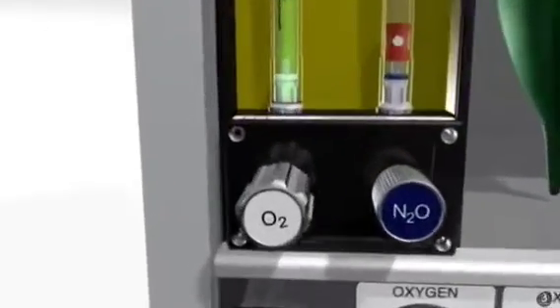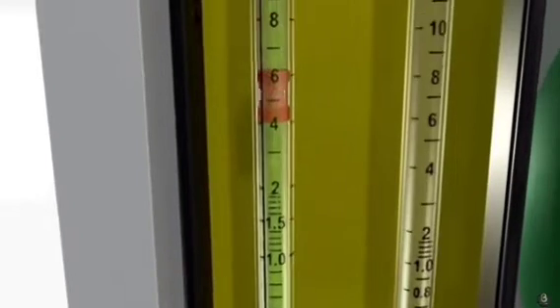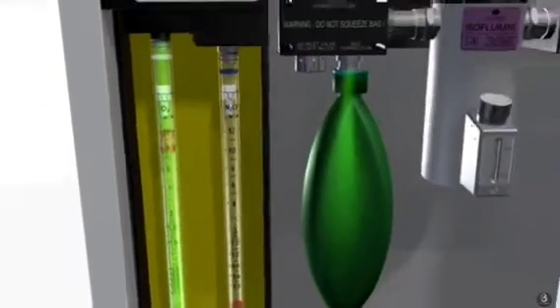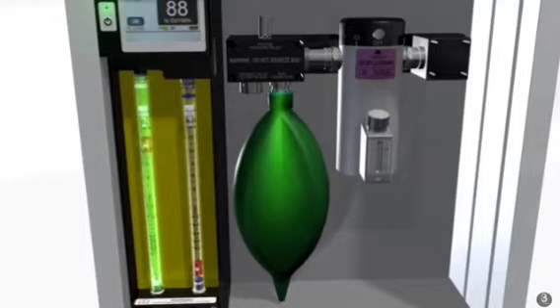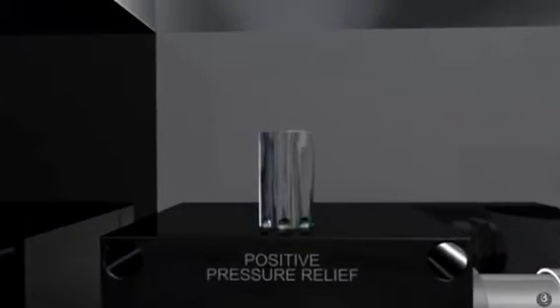Pressure gauges, regulators, and pop-off valves to monitor gas pressure throughout the system and protect the machine components and patient from excessive rises. Flow meters such as rotameters for oxygen, air, and nitrous oxide. Vaporizers to provide accurate dosage control when using volatile anesthetic. A high-flow oxygen flush, which bypasses the flow meters and vaporizers to provide pure oxygen at 30 to 75 liters per minute.